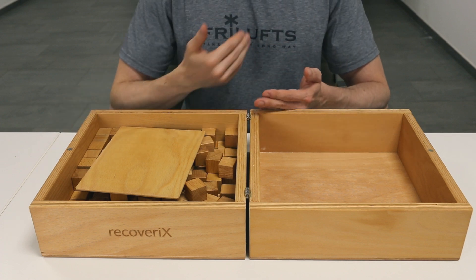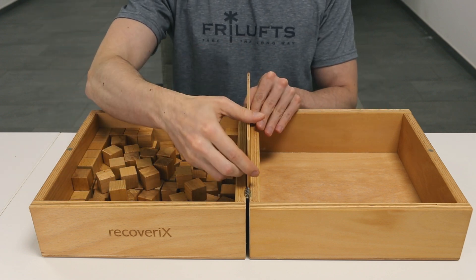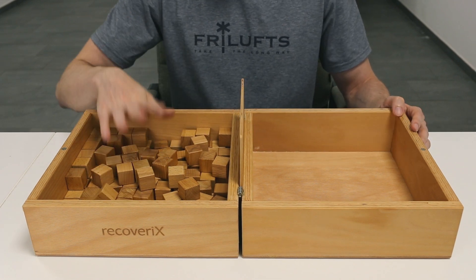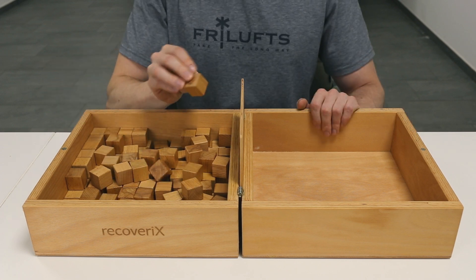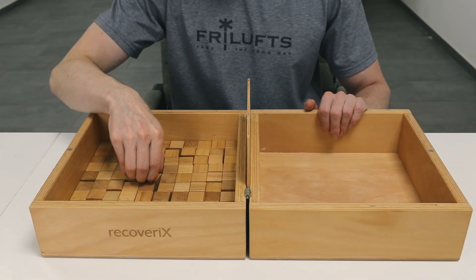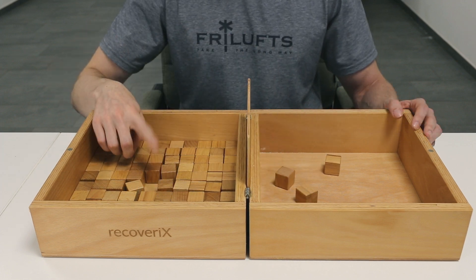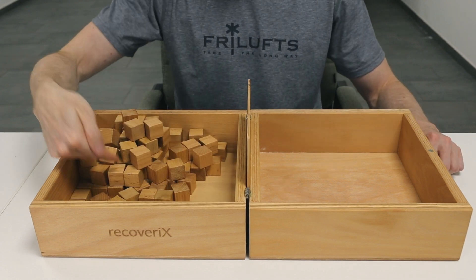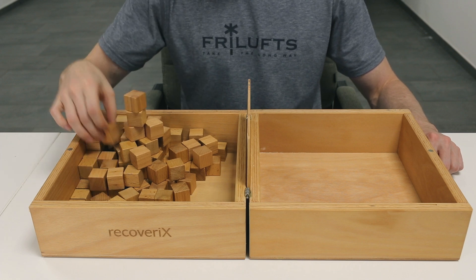In other words, if performing the test with the right hand, the blocks should be in the right compartment. Typically the number of blocks is either 150 or 100, as in our case. Importantly, these blocks should be 2.5 centimeters in size. The blocks should be scattered randomly within the container, with no more than two blocks stacked on top of each other. The distribution should be loose and varied, avoiding perfect alignment.